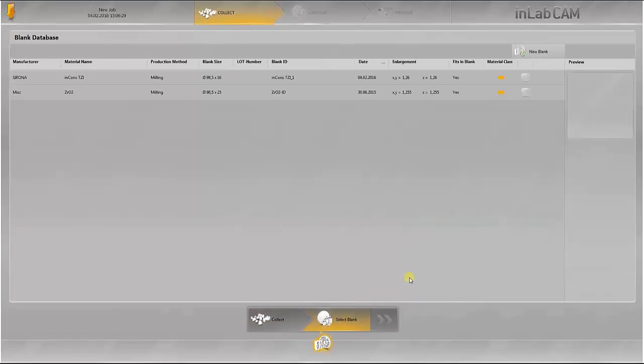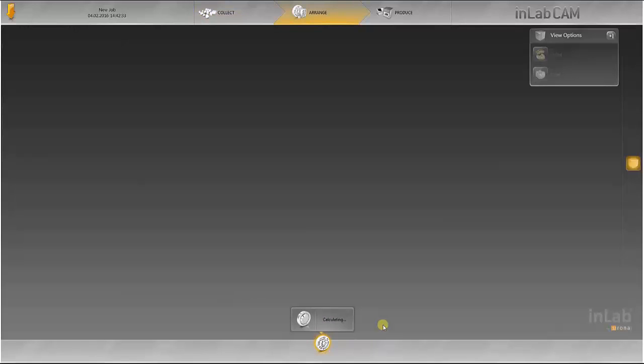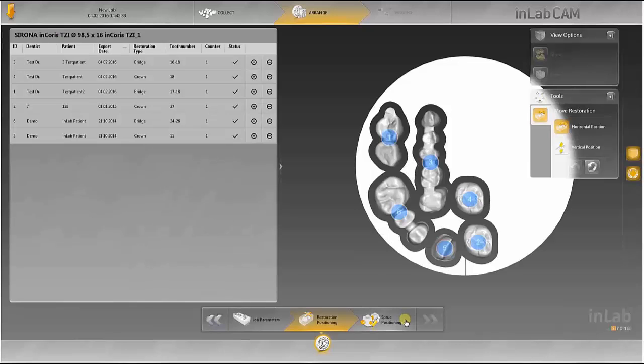In this case, an already saved blank can be used. You see here that designs have already been imported and positioned in the blank. The additionally selected items are automatically positioned in the blank.